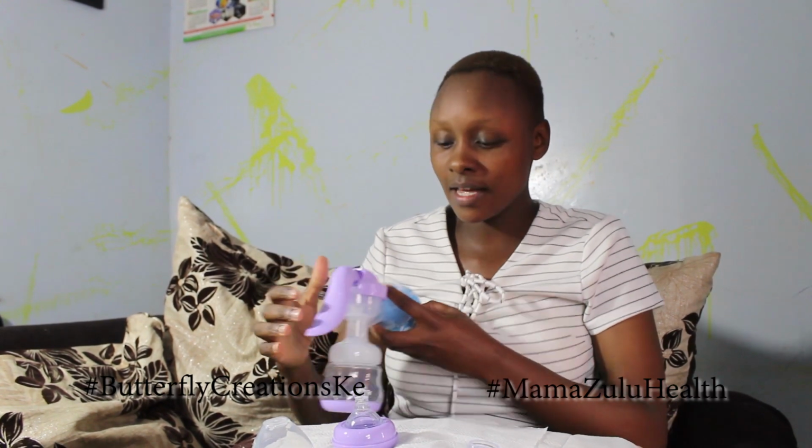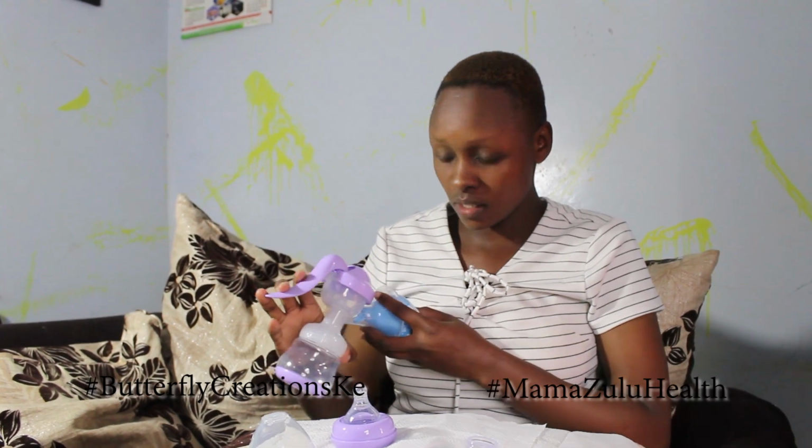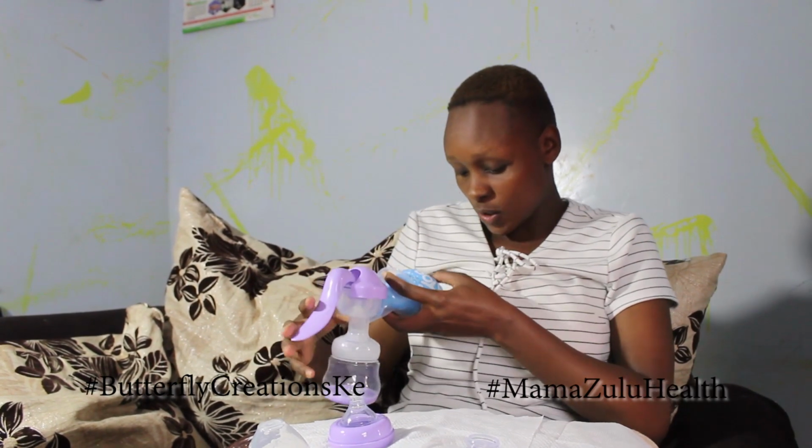So for the first pump, you apply a lot of pressure. Because with a baby it's very easy, but when you're using a pump on the breast, there is no continuous flow. So for the first 2 or 3 times you apply pressure to get the milk out, but once the milk is out, the flow is continuous.